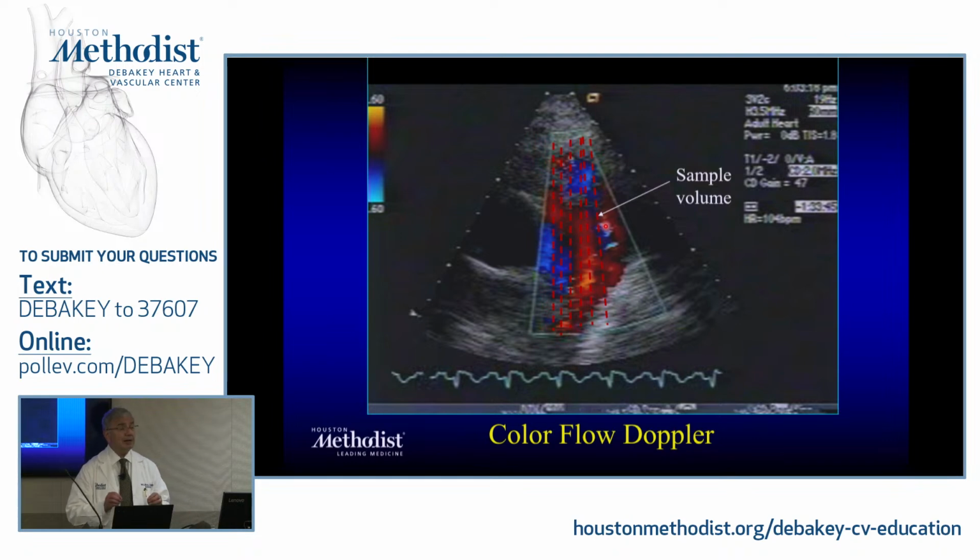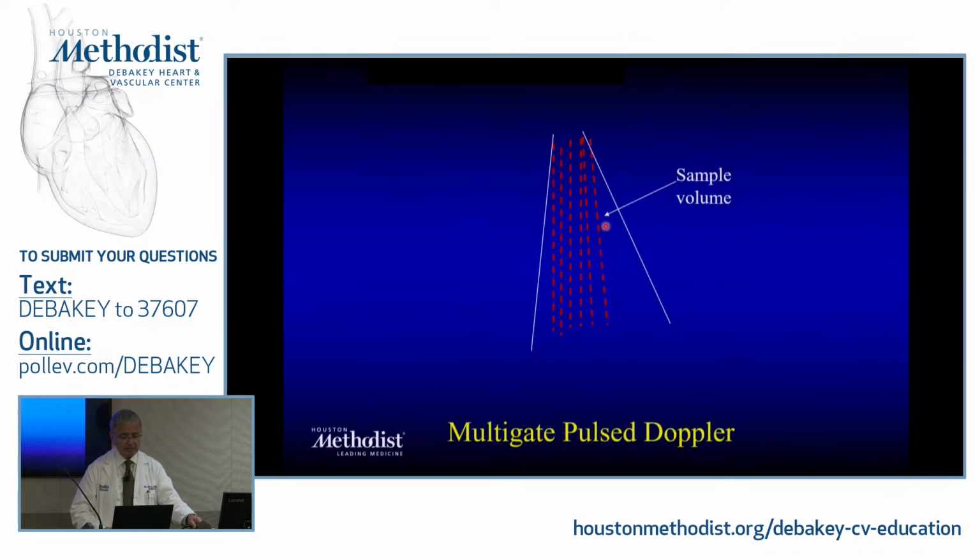Therefore, I'm not going to be able to use a fast Fourier transform because I don't have time. Just imagine, I have to resolve every little area to tell me where the flow is going. So I get an autocorrelation estimate of a mean velocity or a mean frequency shift occurring in this area. So you're not able to determine actual velocities when you alias. If it goes above 60, it's going to wrap around, and that's why in high jets you're going to see some aliasing.